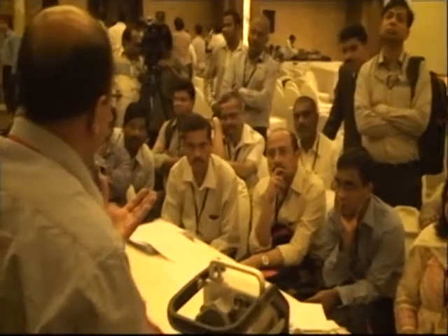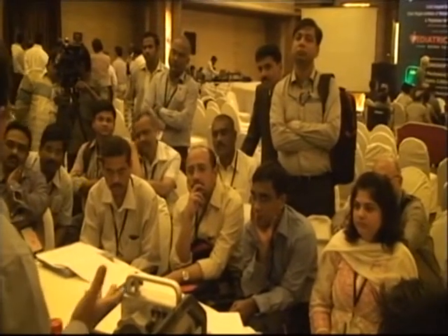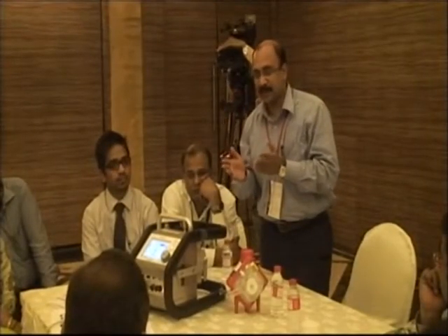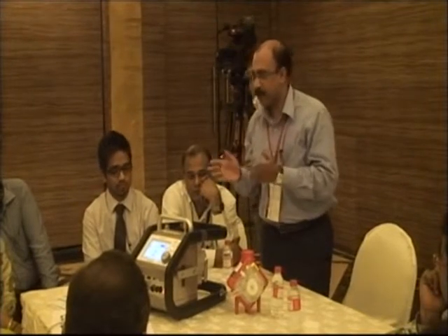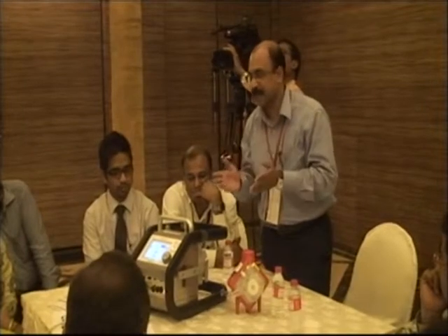You would have done everything, and I'm sure you have used the oscillator with nitric oxide. And that is the time where you decide, my baby is still low, what to do next. The oxygenation index is more than 40, it can be 50, 60 or whatever. At that stage, before the child lands up in multi-organ failure, if you have a center and if the patient can afford it, this is the answer for that.